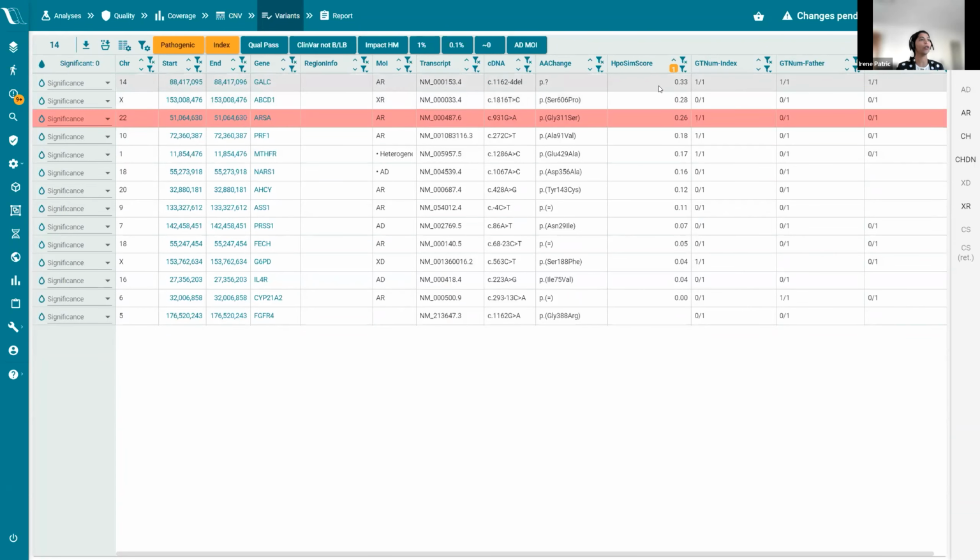You already see that it is sorted based on the score, and the ones that are highly relevant come on top.